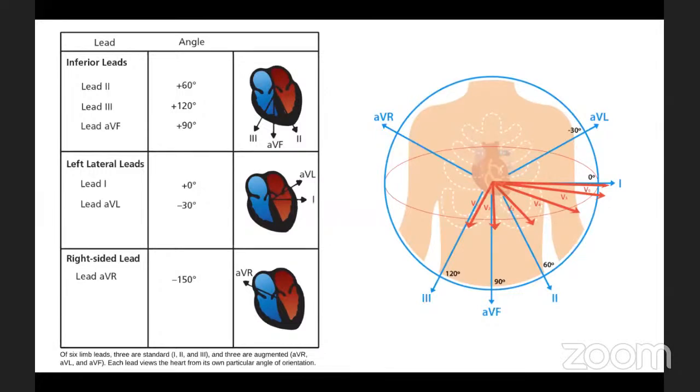There's no back. You're close. Not posterior, we're going to look at it anteriorly. Perfect, yeah, there's anterior. We're going to look at it anteriorly. So from here, those red lines. We looked at it vertically right now, but now we want to look at it horizontally. Do you see this horizontal circle? Horizontally inside, into the paper, like you're adding something into the paper, so it's horizontally, these ones. Let's discuss them in the next slide.